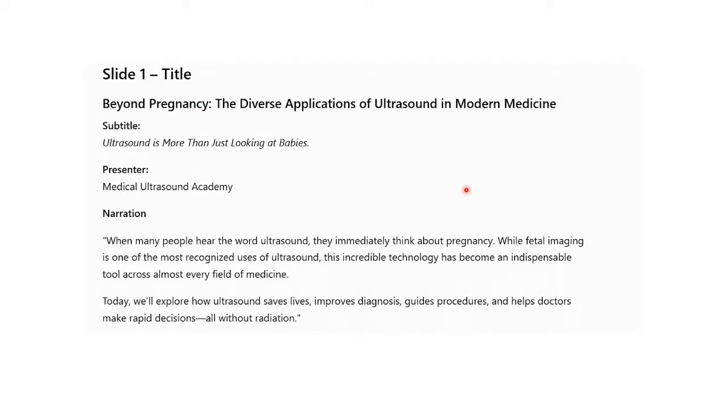Ultrasound is more than just looking at babies. Did you know that? Yes, you do, because you're a sonographer. Yes, you do, because you're a radiologist. But there's somebody who doesn't know that, the patient, and someone who's being introduced to ultrasound for the first time. We've got students. So, the narration.